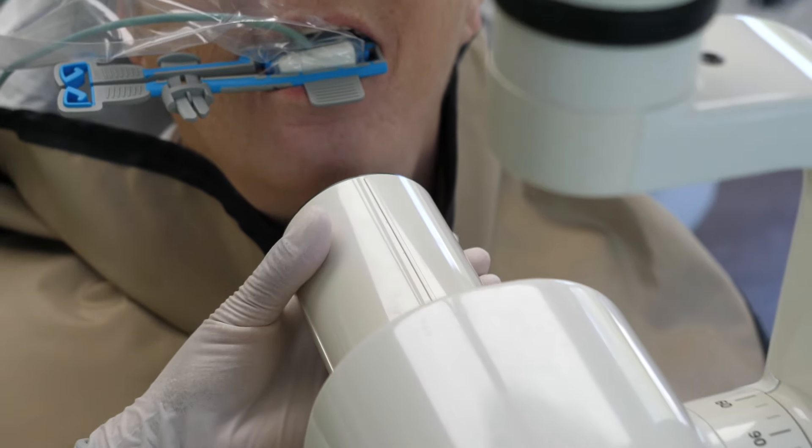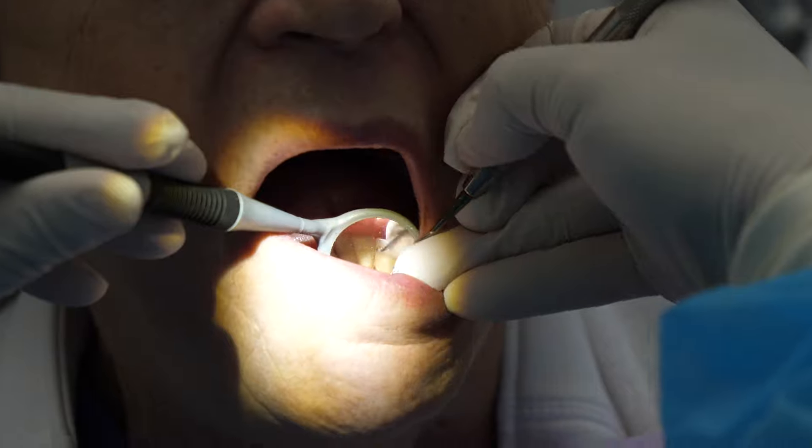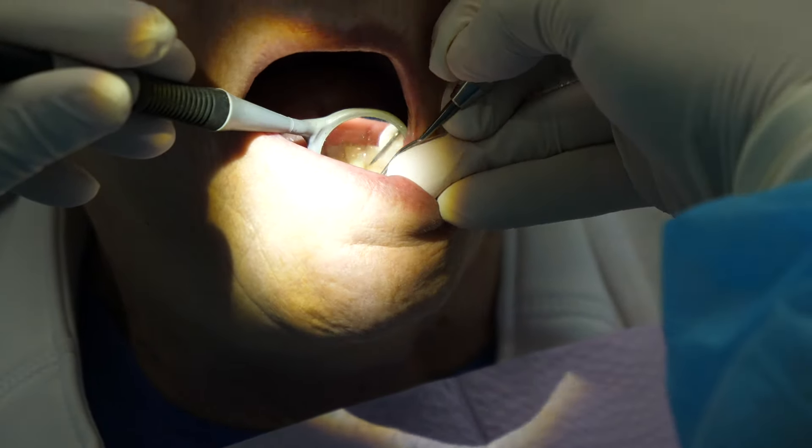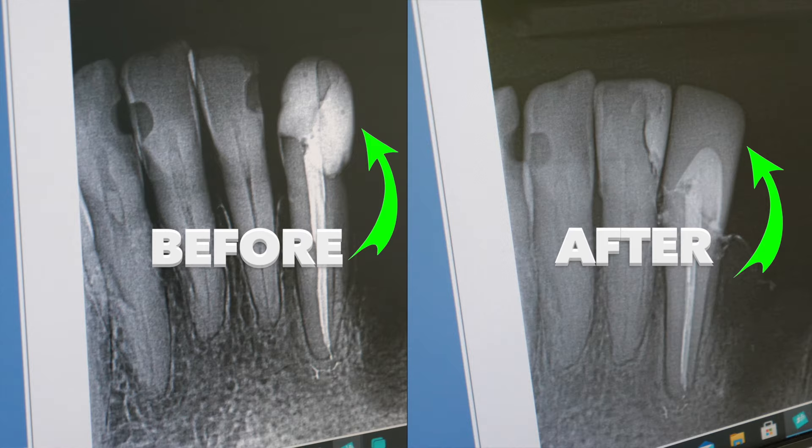Lastly, they may take a post-op x-ray. If there is any residual cement seen on the x-ray, they will go back in with an explorer or scaler to remove it. And that's it — same-day crown complete.